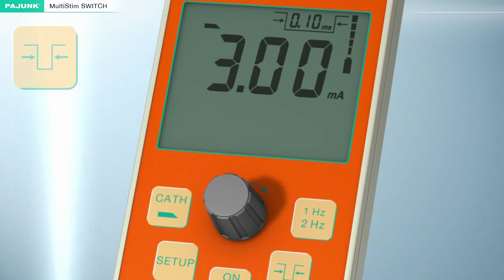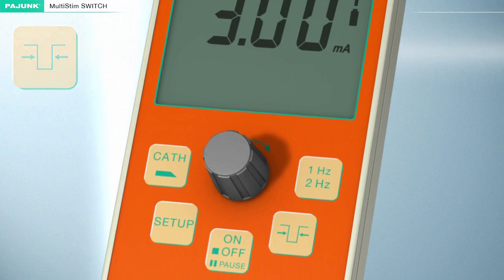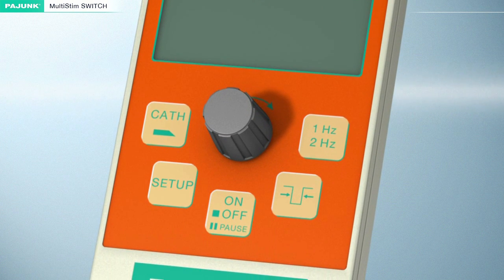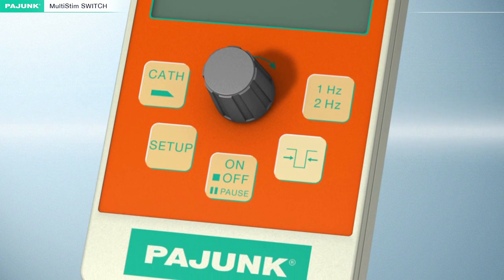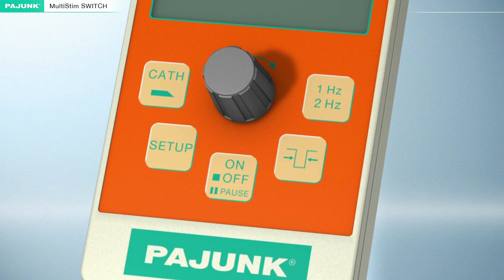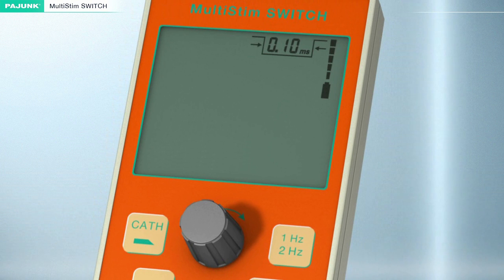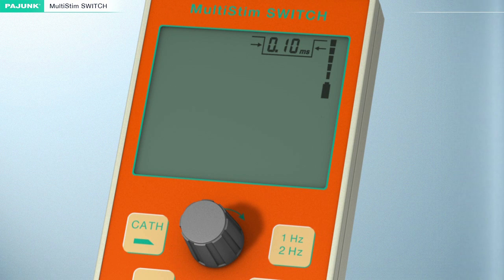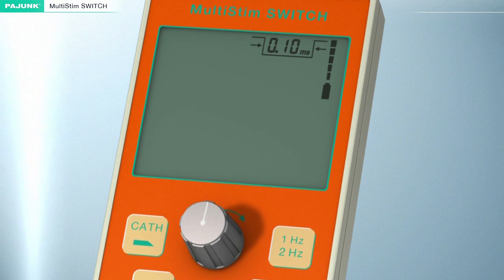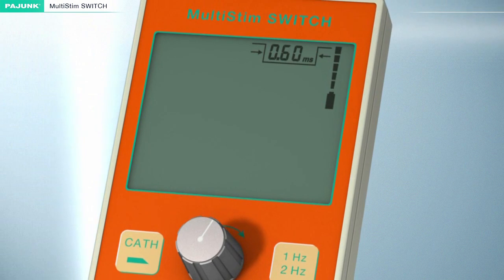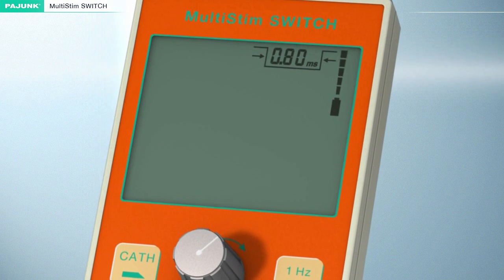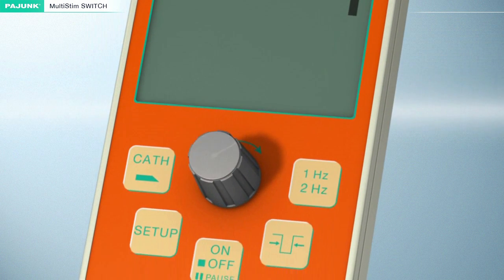Pulse Width. The bandwidth of the stimulation impulse can be changed by pressing this button. The value of the current intensity and the milliampere dimension will disappear from the display. The stimulation impulse bandwidth, indicated in the upper right-hand corner of the display, can be adjusted to the desired value between 50 microseconds and 1.0 milliseconds with the aid of the turning knob.